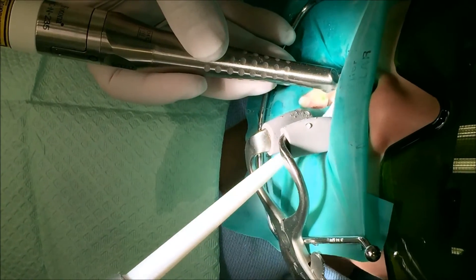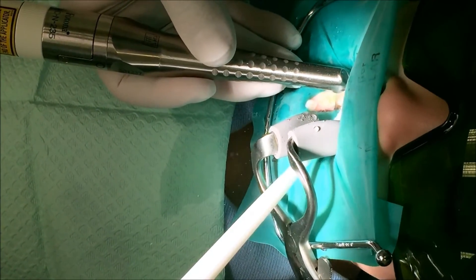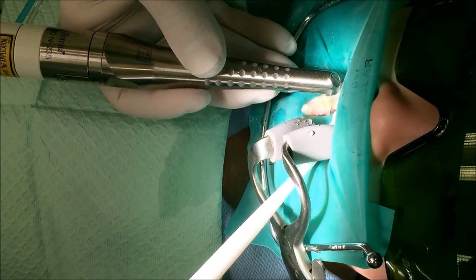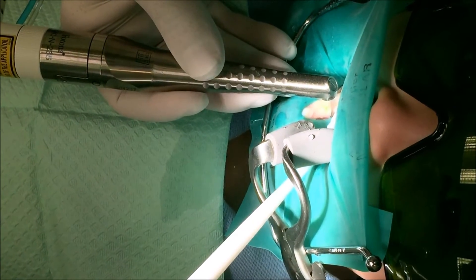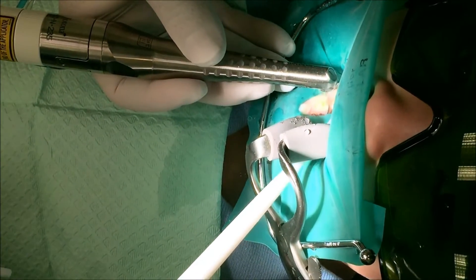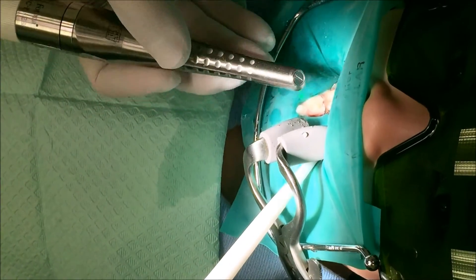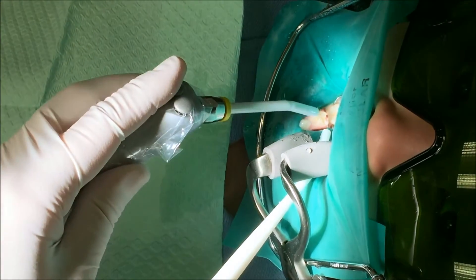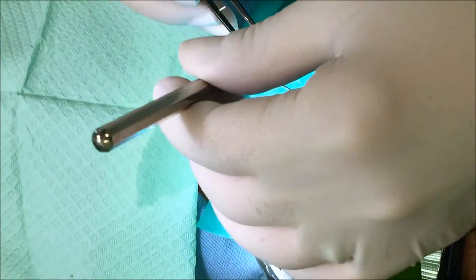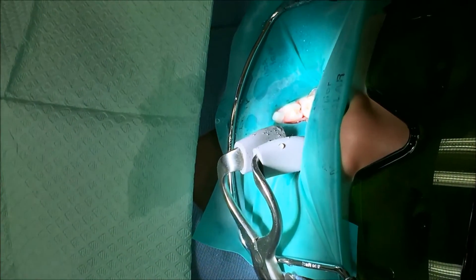Just a lot of water, okay? We're almost done. Try not to wiggle your feet. Thank you. I'm going to pick out the protector. I'm going to smooth out some of the rough edges here.